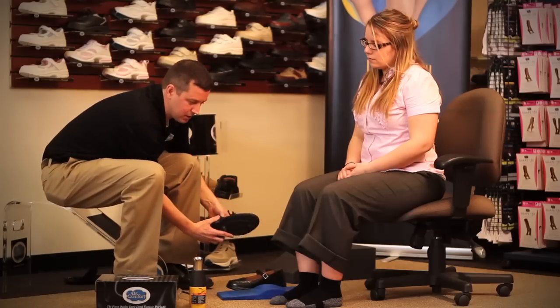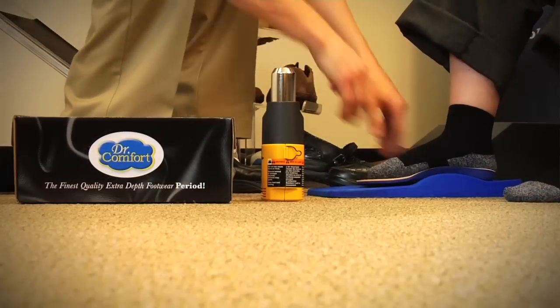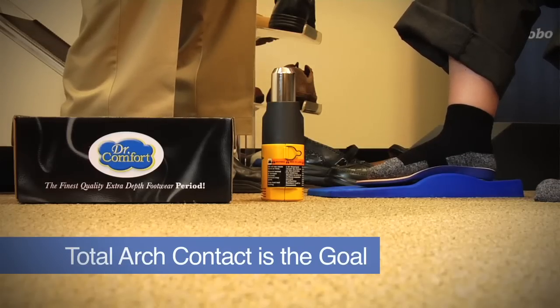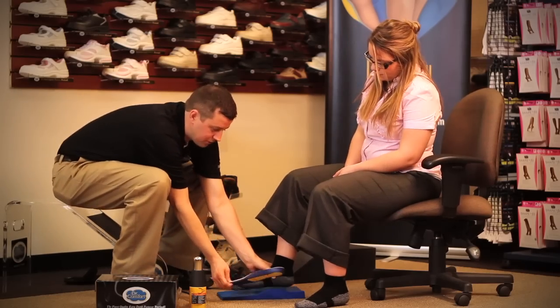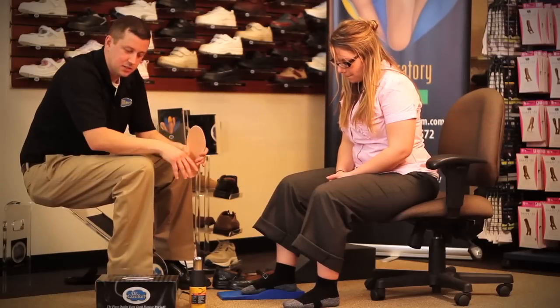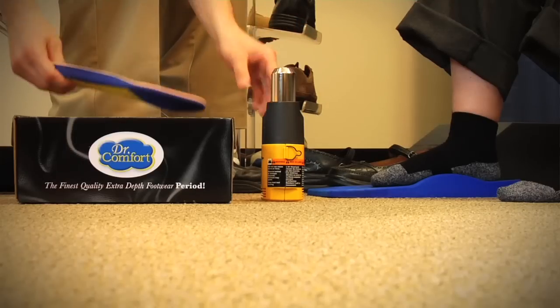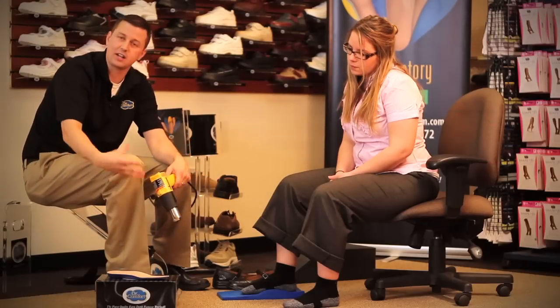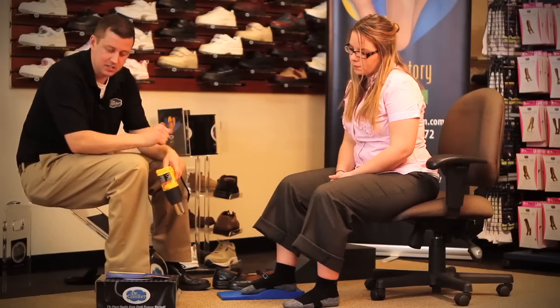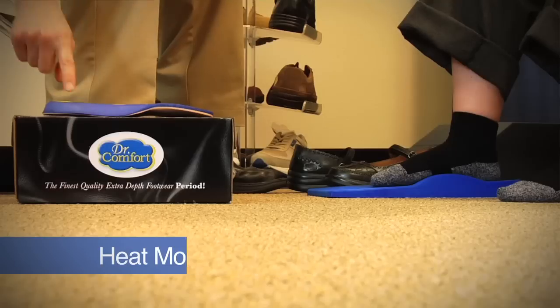Once we've done that, I usually demonstrate to the patient exactly what will occur. We will heat mold this insert and have them put their foot right on the insert as it's warm. That ensures we're going to achieve total arch contact, which is the main purpose of heat molding these inserts. Two techniques can be used with the heat gun: first you could use it standing up and move the insert over the heat, or you could use a surface such as a box top that will not conduct heat. I'll use the second technique — you want to start with the bottom of the insert, mainly focusing on the forefoot and also the arch, then heat mold the top side.